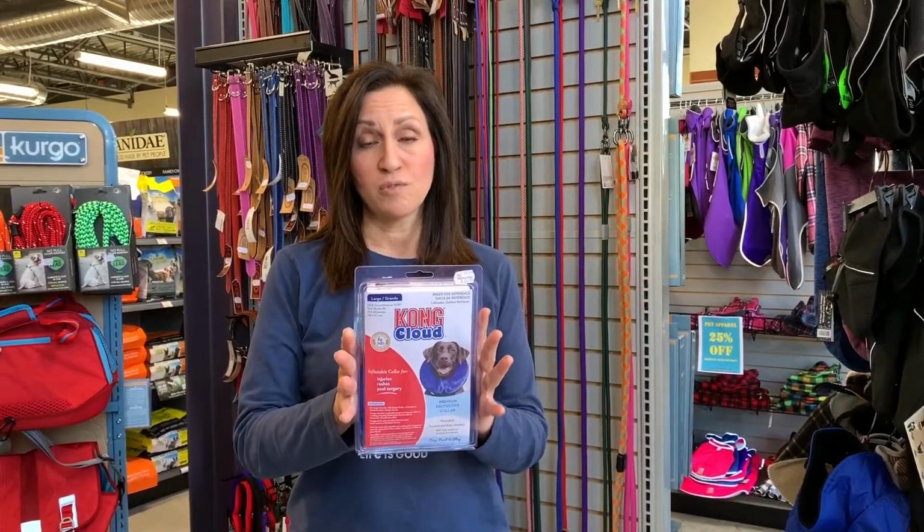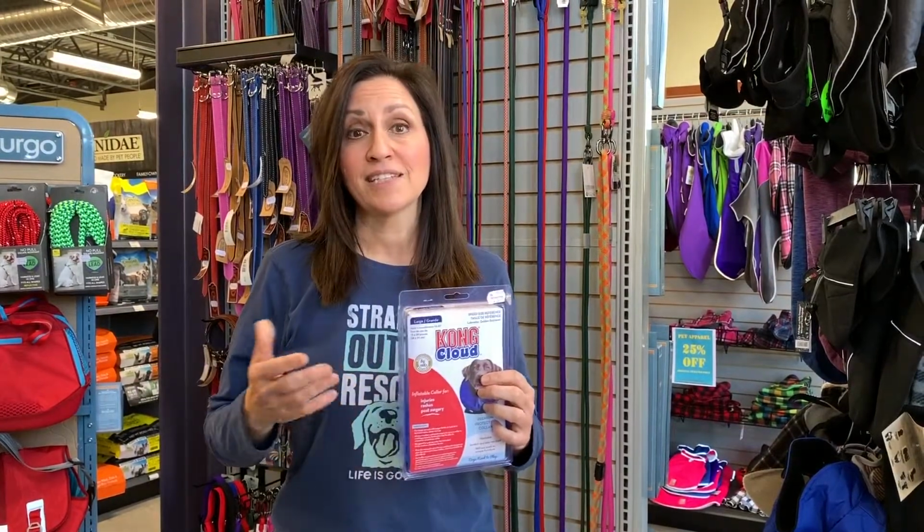Now, there is one major thing that you need to look for when you're buying one of these, and that is that the inside of the collar, the part that's around their neck, has loops. If it doesn't have loops, all it takes is a couple swipes of your dog's paw and that thing is going to be off. If you're not watching your dog at that time, that's where they can start licking.